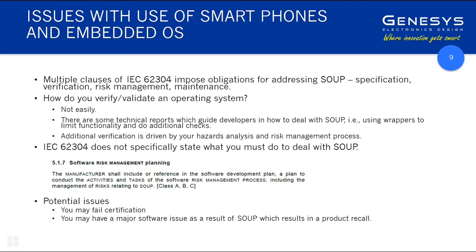So the potential issues with that: you may fail certification, or you may have major software issues as a result of SOUP, which results in a product recall. What it comes down to is that if you're going to use SOUP, there are additional risks and someone has to accept the responsibility of those risks.